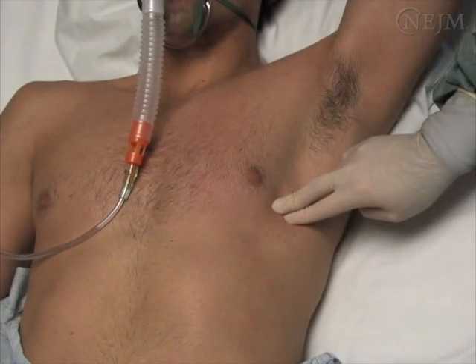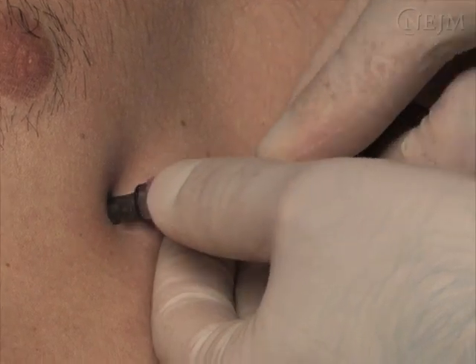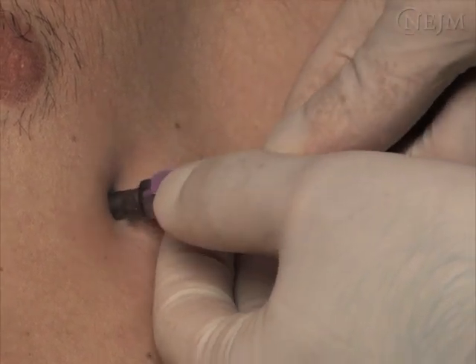The incision will be made here. The chest tube will actually be inserted one interspace above this point. Mark the incision spot with the imprint of the back of a needle or a pen marking.